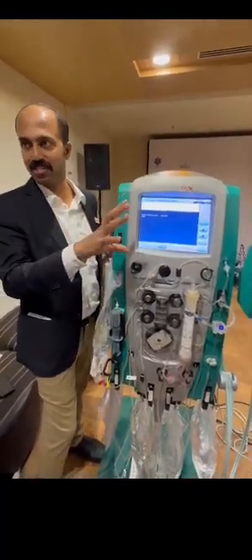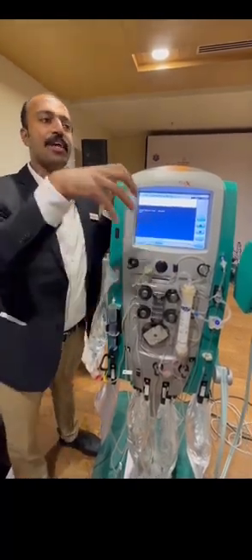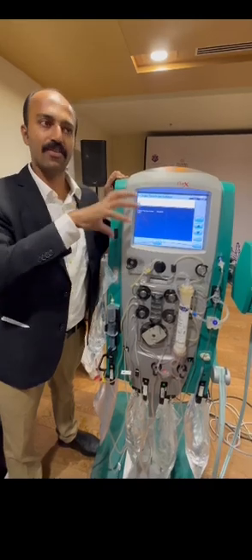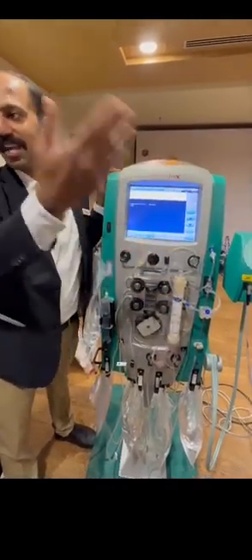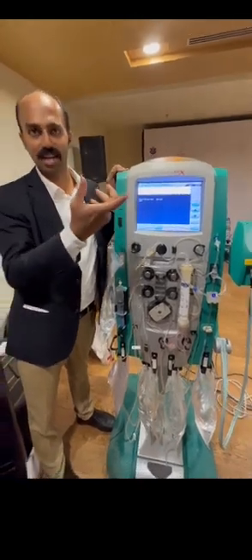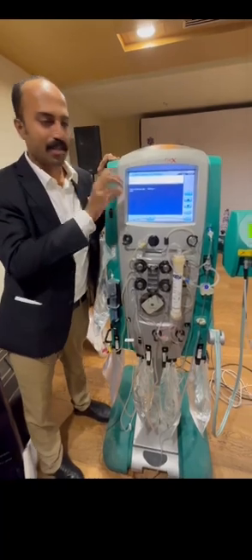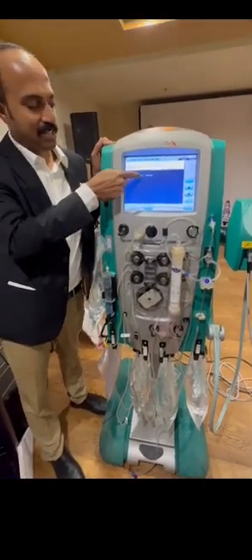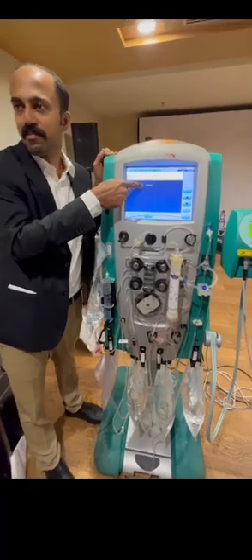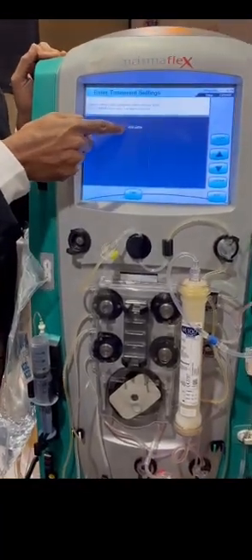Okay, that is average. Maybe that is 30 liter, maybe that is 20 liter. So we have to remove that exact 24 liter. Otherwise, in ICU patients, if I am extra, if I am removing 1 liter extra, that will be a challenge. So the machine is again rechecking. At that time there is a chance of some deviation. That deviation is this. Okay, maximum if anything happens, 400 ml per 3 hours. Per hour around 130 ml.